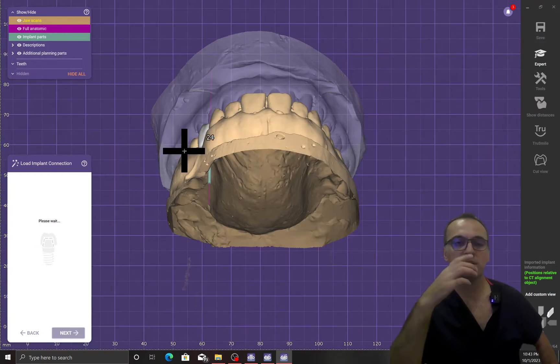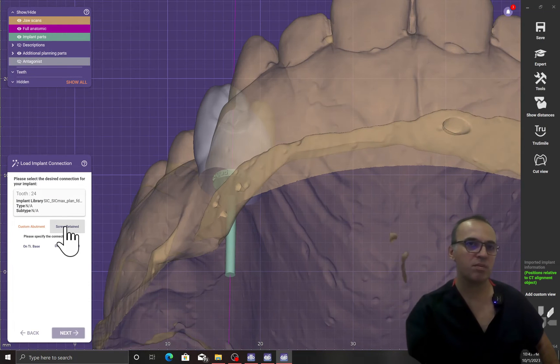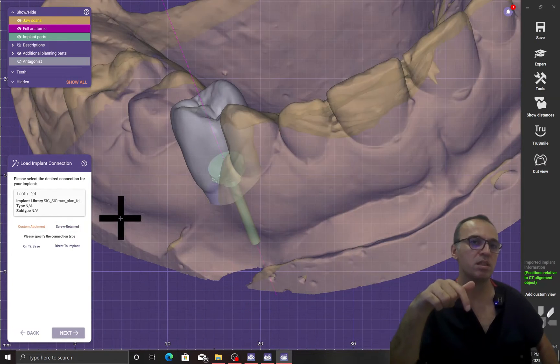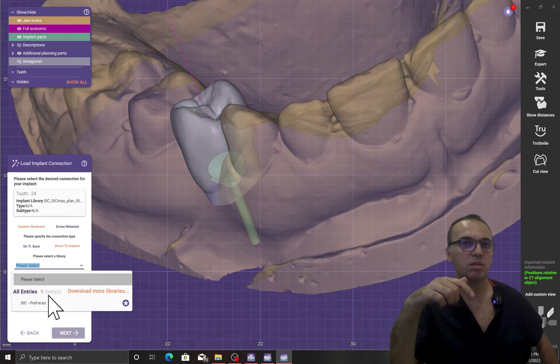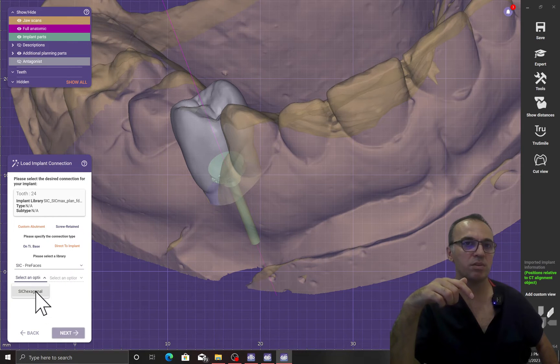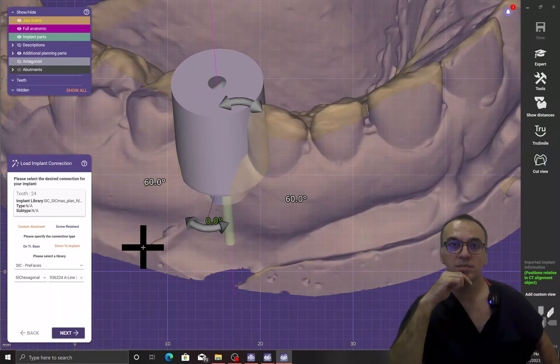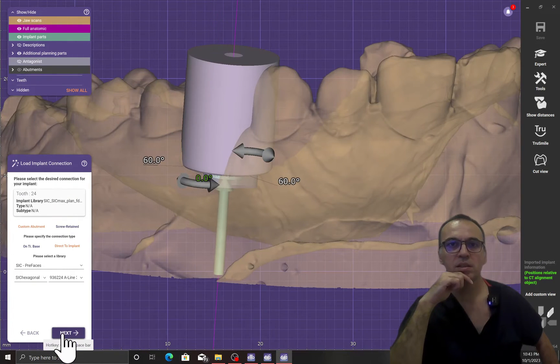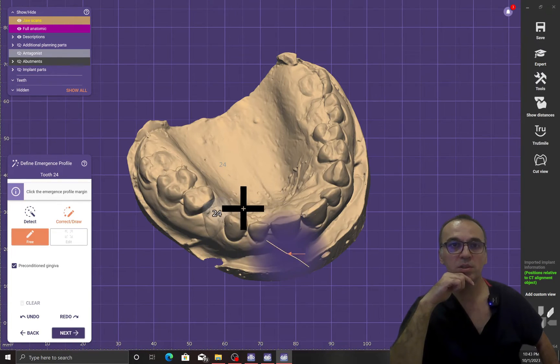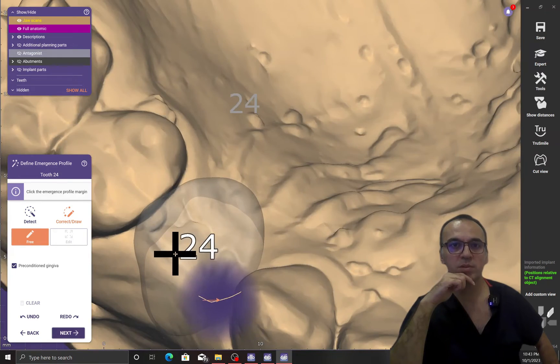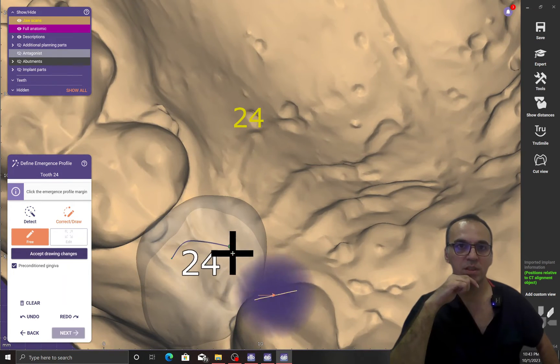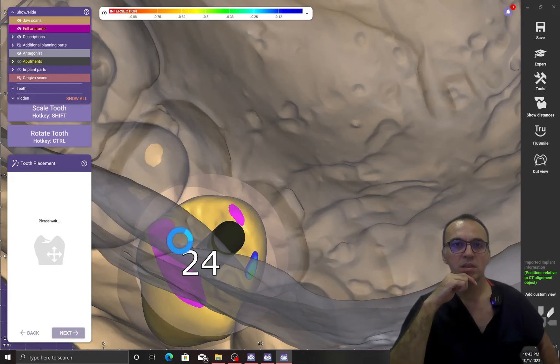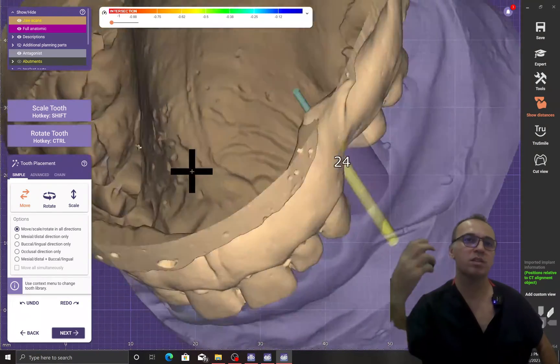It asked me whether I wanted to screw it in or want a custom abutment. In this case we are going to do a custom abutment — we will do the previous abutment. And I'm going to show where is the emergence profile for this implant.